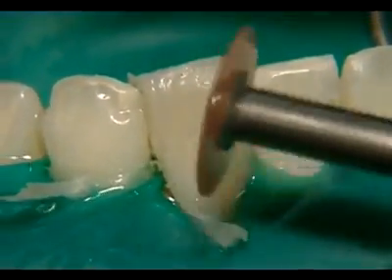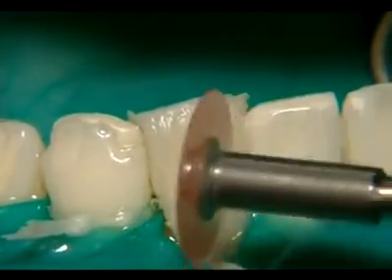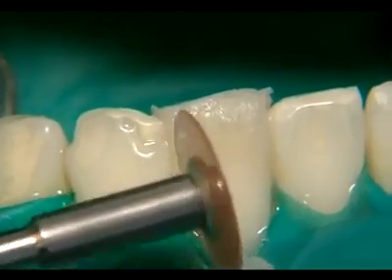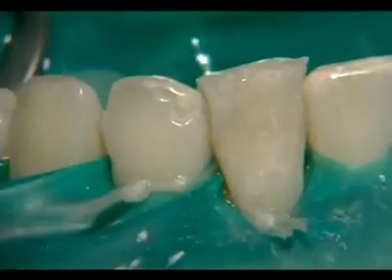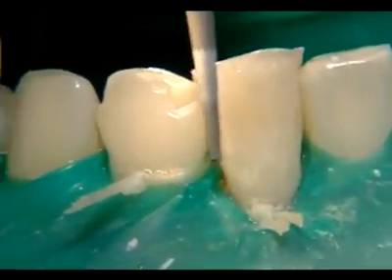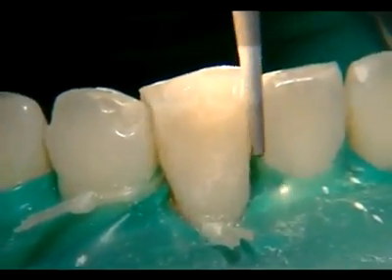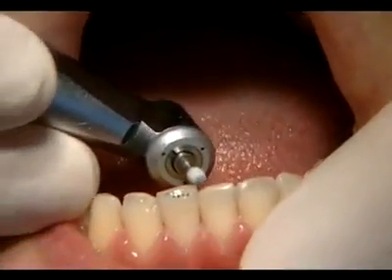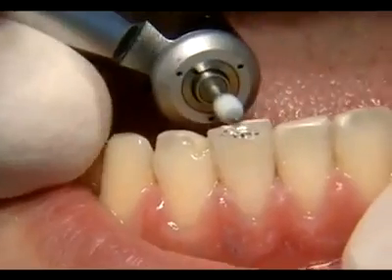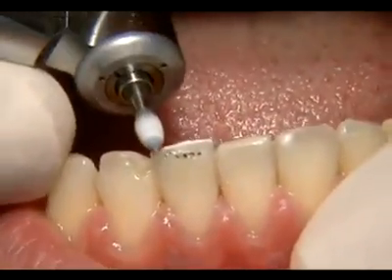After the wedges and matrices have been removed, the restoration is pre-finished, using flexible discs and fine diamonds. Next, the rubber dam is removed, and the final shaping procedures are carried out. In the process, the occlusion and articulation are checked and adjusted.